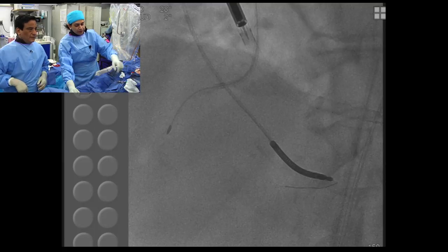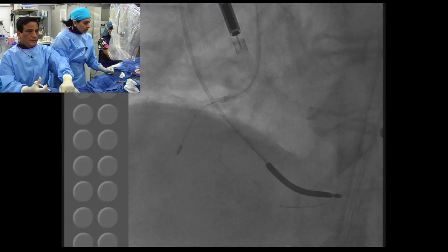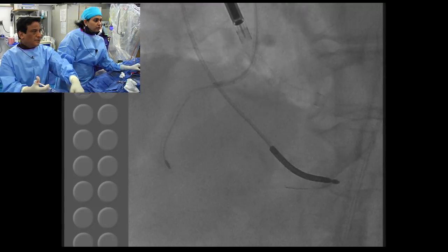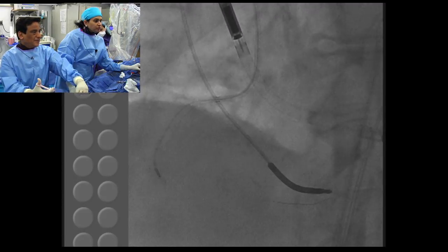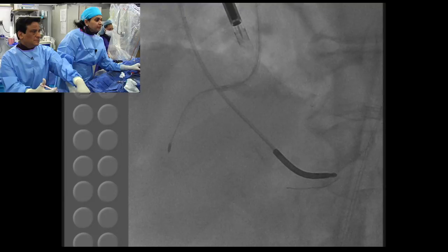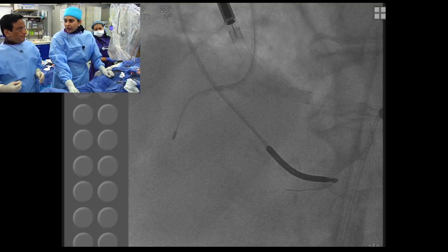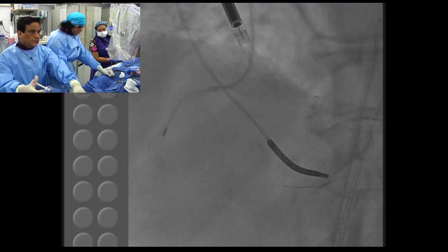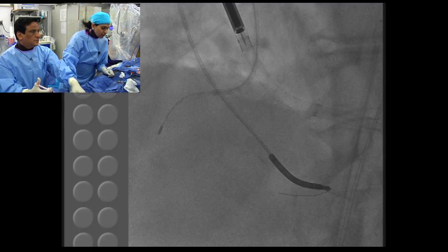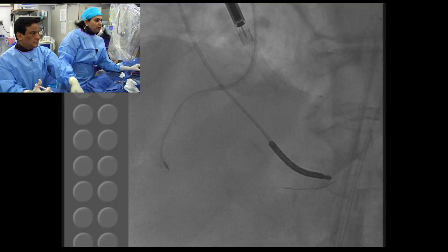One other thing is, I think she's becoming pacer dependent. As soon as you lose the atrial kick, she has a single chamber. How much augmentation do we have? 2.8. She should try to get a little more, like 3.5, once you use a CP. You did give some fluids, right? That's also important. You need a good EDP before you start sucking more blood. Anu, what is the comfortable range of EDP you feel? Has to be above 20 to about 25? 16, 18. We were at 12, that's why we gave some bolus fluid here.